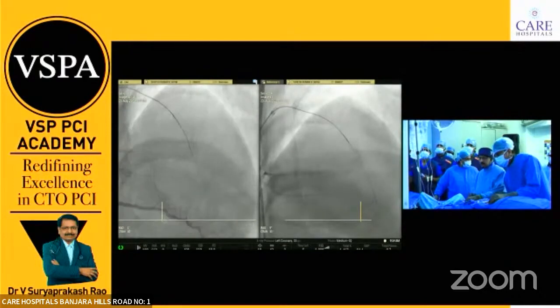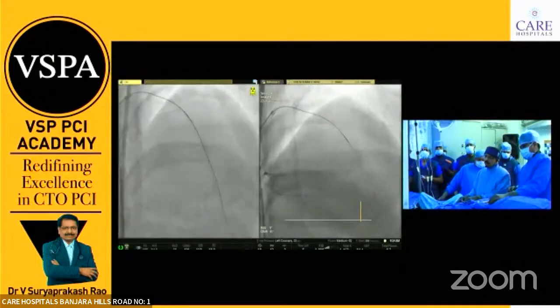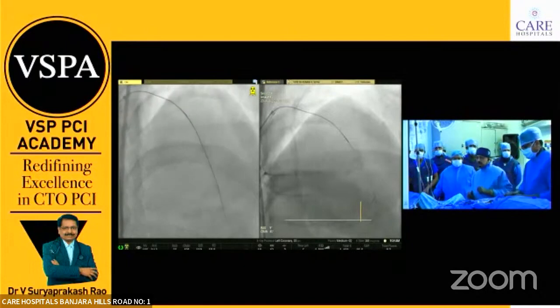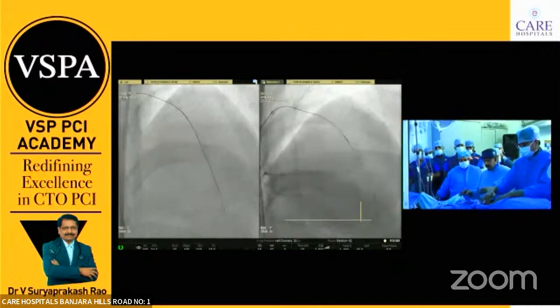It's okay. Now we are in the correct track. I will try these two techniques now. If you can track the Corsair down, you can exchange the wire, if there is no calcium plaque.